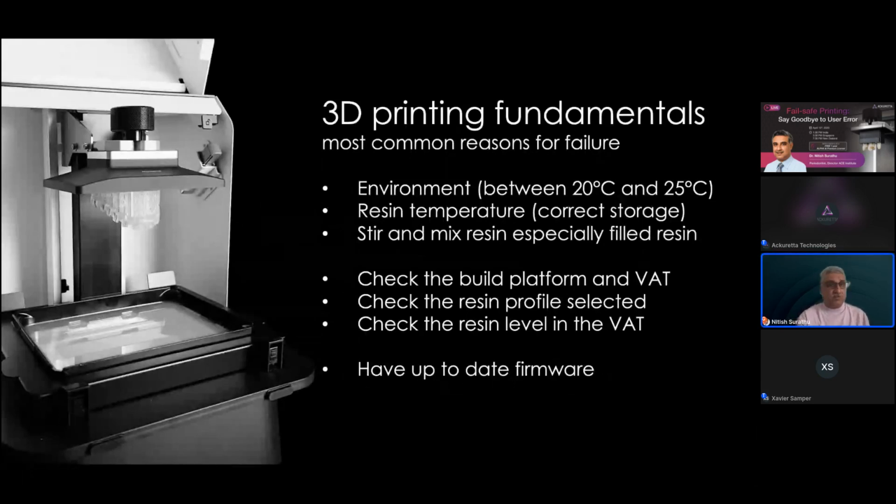Make sure as well that you've selected the right resin profile. That will show up even on your printer screen when you're about to start printing. I have personally selected the wrong resin profile, thinking that I'm going ahead with something else. And that can so easily happen to somebody, and you don't realize you've sliced up the print for a completely different resin profile, whereas in reality, you're printing in a completely different resin. So that's something to get right as well.